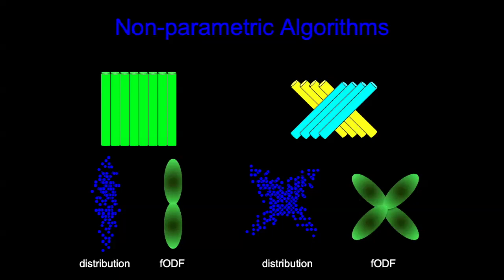Yep, that's good. But there are other orientations besides crossing fibers that can be problematic for DTI. There's also fanning, so if you imagine axons come in and then spread out and go different directions, or kissing, so they come in and then touch and then go on.